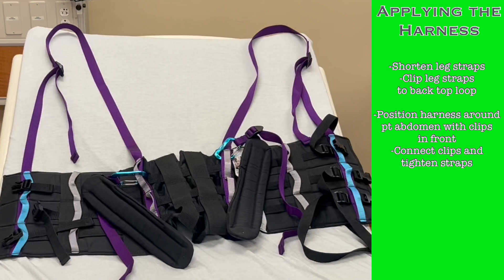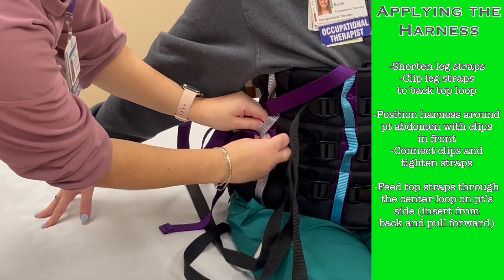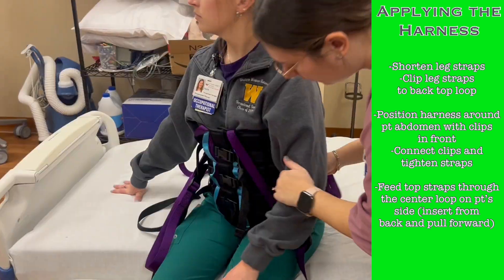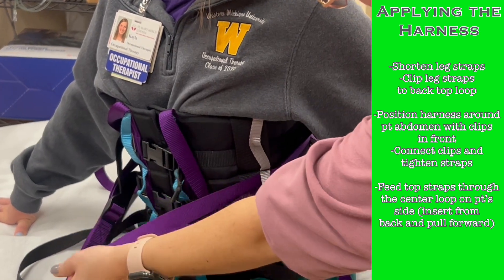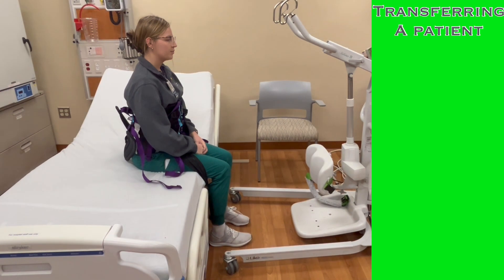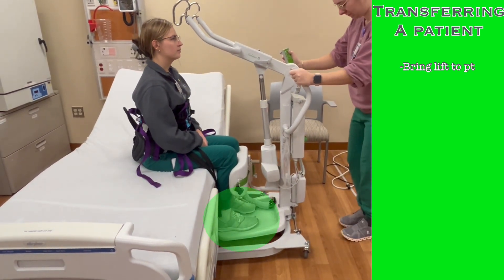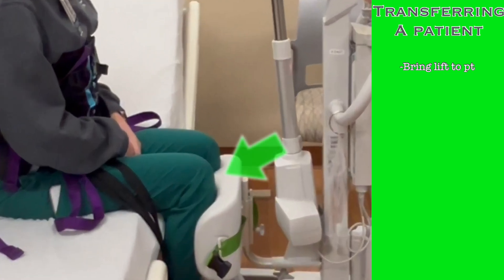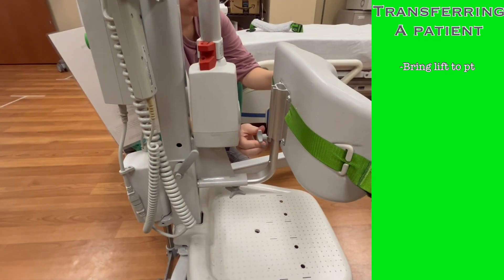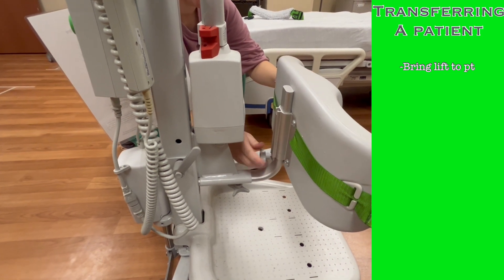Now you need to position the top straps. On either side of the harness are a series of loops. Take the strap and put it through the center loop, inserting from the back and pulling the strap out toward the front. Repeat the same process on the other side. With the harness on, bring the Sabina to the bedside. The patient's feet should rest on the platform and their lower legs should be pressed into the formed cushion. Their knees must be above the top of the cushion. You can raise or lower the cushion if necessary by loosening the bolts on the back of the cushion and tightening them when you have it in the proper position.